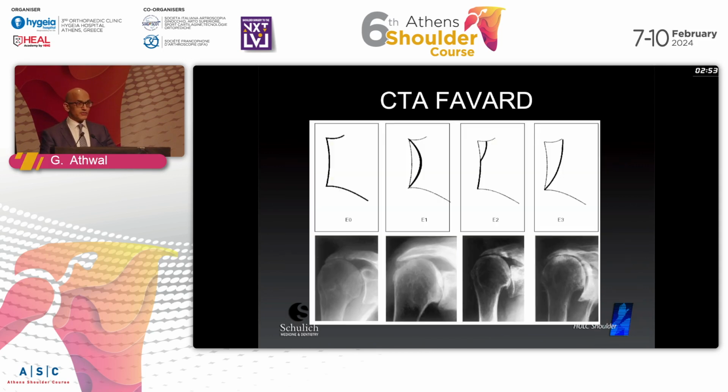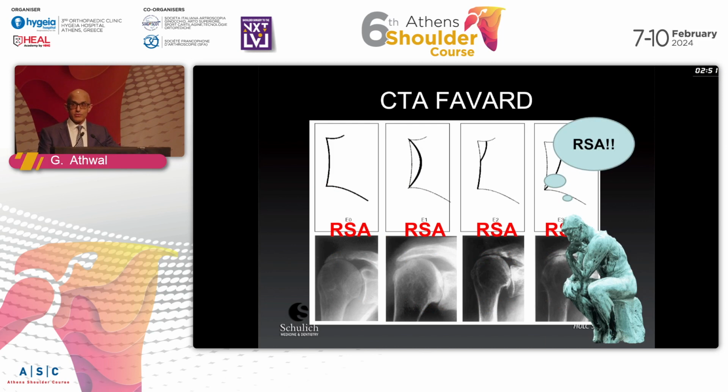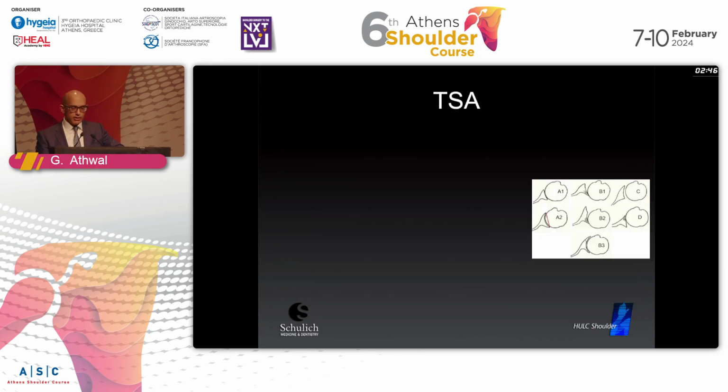With the Favard, it's very easy. Every one of these is a reverse. We know with massive rotator cuff tears and cuff tear arthropathy, that certainly would be the standard of care now.